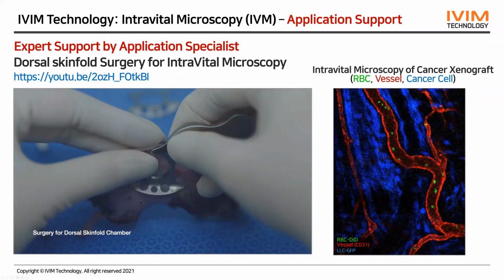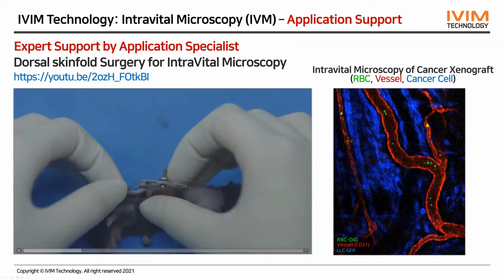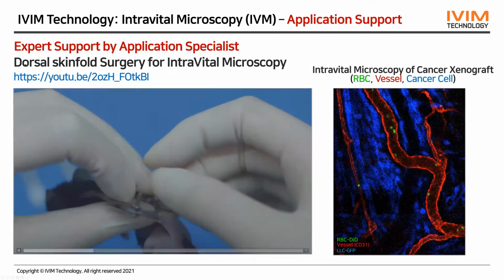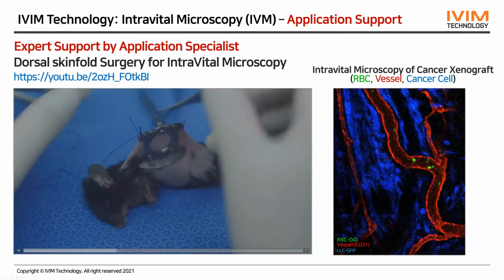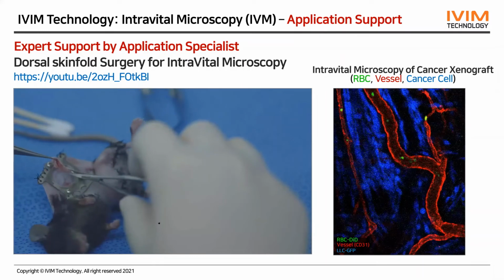So this is the video we uploaded after we recorded it in our company, IVIM Technologies. This is the surgical procedure for the dorsal skin fold imaging chamber, which is a well-established imaging chamber device for cancer drug imaging.